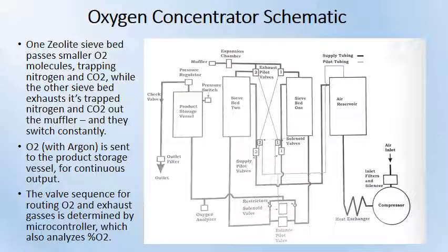All right, so the block diagram gave us a simplified understanding of the process and the sieve swapping, but it didn't go into all the details that are involved in the system. Now here we have a pneumatic schematic of what's actually going on in the system. It has more detail. For instance, you see the compressor goes into a heat exchanger.